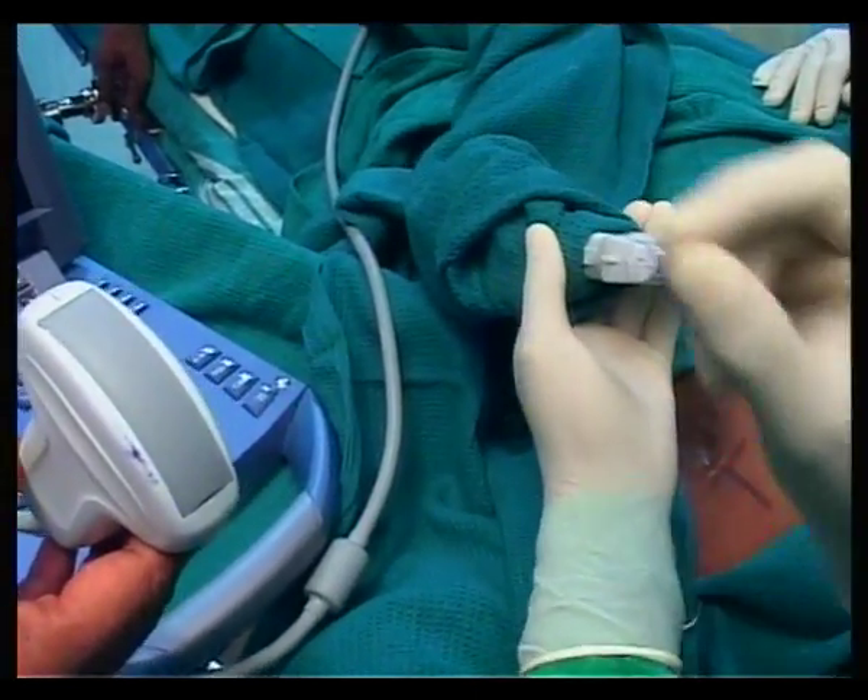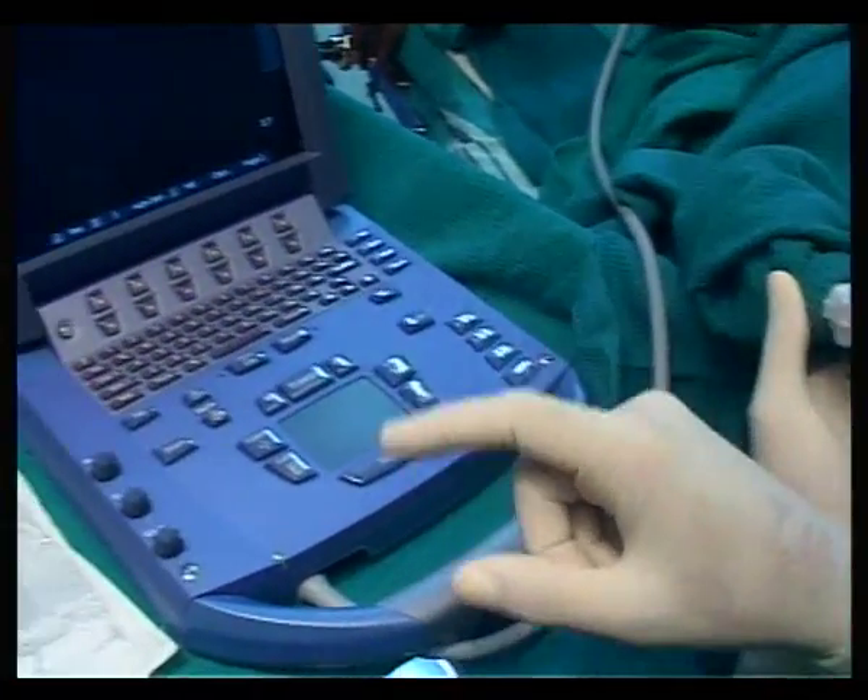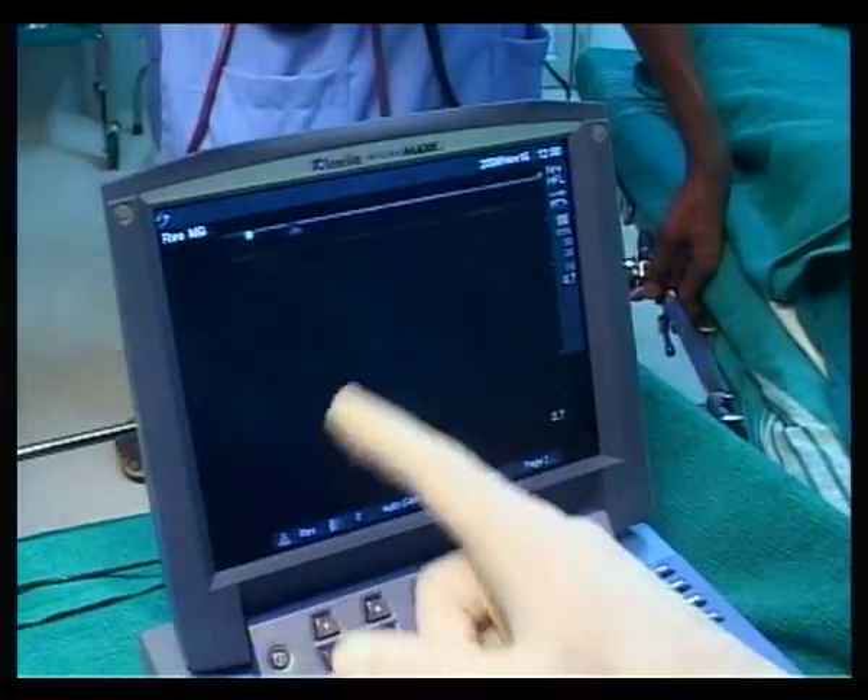If you look at the ultrasound machine screen, there is a dot which corresponds to the marker on the ultrasound probe.